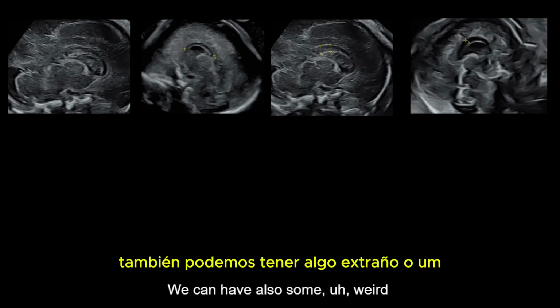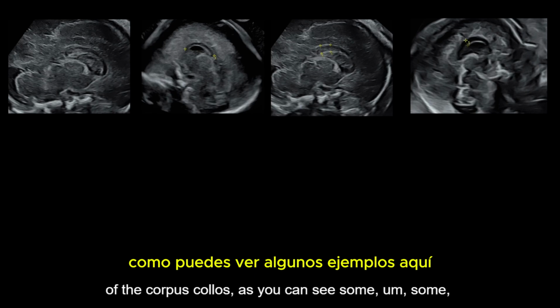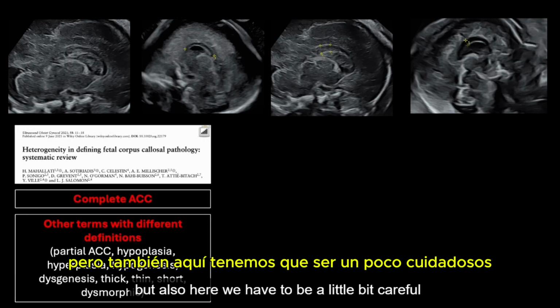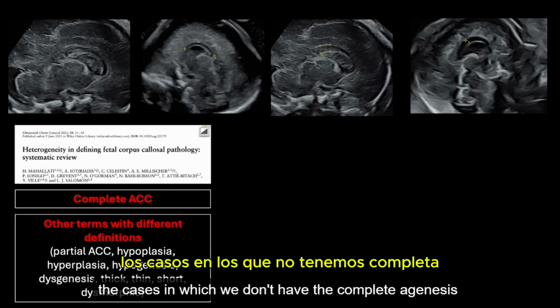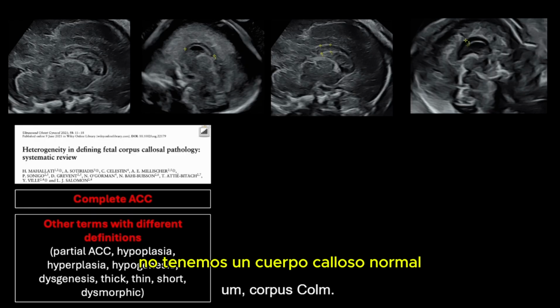We can also have some weird or more atypical appearances of the corpus callosum, as you can see in some examples here. So we can have a partial agenesis of the corpus callosum, but also here we have to be a little bit careful, because in the literature there are really different definitions of the cases in which we don't have the complete agenesis of the corpus callosum, but on the other side we don't have a normal corpus callosum.